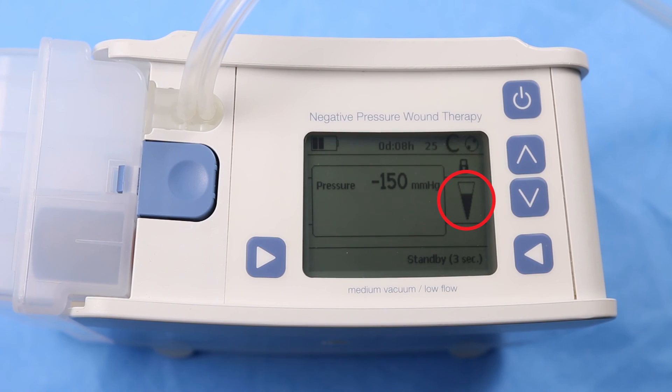When the indicator is half full, there is an air leak in the system, although the pressure and therapy are maintained at the set pressure. It is recommended to check all connections on the pump side and to check the dressing to ensure it is sealed tightly. The air leak indicator alarm will not sound in this situation.